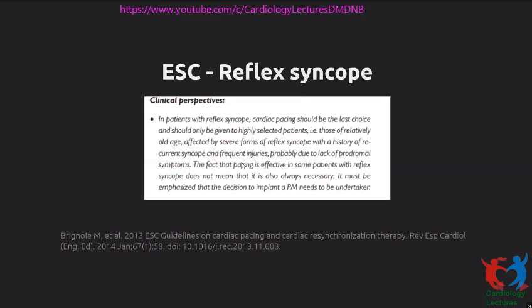And also a very relevant point here: the fact that pacing is effective in some patients does not mean that it is necessary. You could put in a pacemaker and say the syncope frequency has come down or syncope severity is mitigated. That doesn't mean that you have to pace these patients. A patient who has, say, 2 episodes of vasovagal syncope in a year and doesn't have injury from that, what is the need to pace them? You're not changing outcomes in any way. So always think of clinically meaningful outcomes and discuss with the patient before considering a pacemaker in these patients.